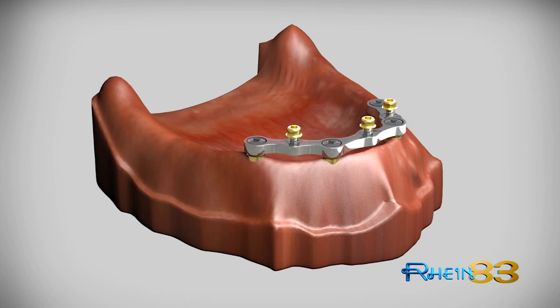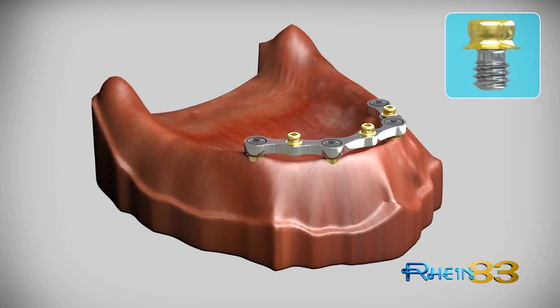The Rhein83 threaded attachments are available in all major CAD CAM software libraries and offer multiple solutions for maximum reliability and retentive function.